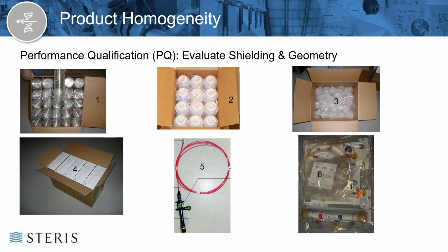It's low density. It should provide you very good DUR. 4 is a bit of an unknown. And to that point, for our studies, we need to open up all the product cartons. We need to make it very clear within the studies what we are characterizing the dose distribution to, so it can be supportable of a certain product validation on one of our systems. We need to be clear on where we placed all the dosimeters, how the product was received, how it is configured within the volume.